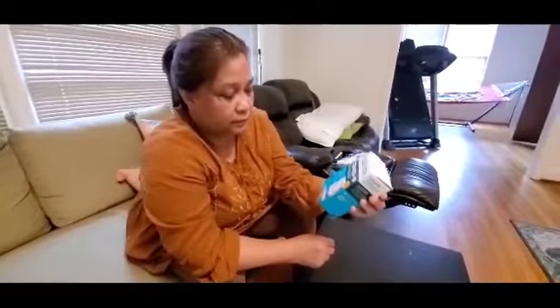This is a home test kit self-test. This is the first FDA approved home test kit.